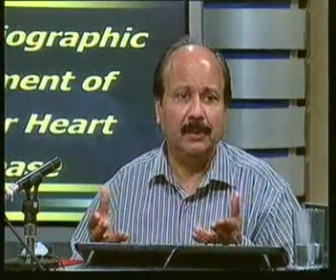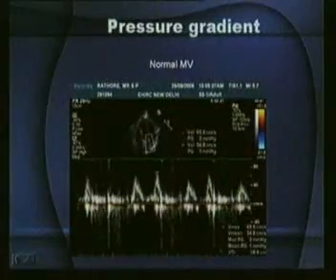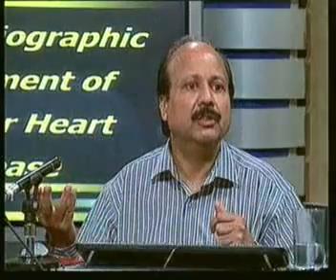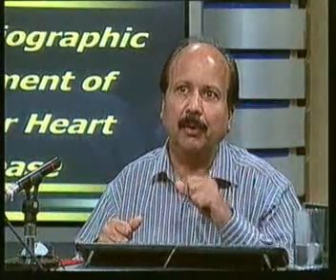Now you can very well imagine if the patient gets atrial fibrillation, then you're going to lose that A wave, right? Because now the atria are not contracting in a synchronized fashion. What will happen to the patient? A patient with atrial fibrillation and mitral stenosis might come to you immediately with palpitation, but more importantly with signs of congestion, because now his LA is not emptying. He gets back pressure, he gets pulmonary venous congestion. It's very common to find young patients who till yesterday were doing relatively well. Within 1 hour, the A wave is knocked off and they're down in left atrial decompensation, right? So that's the importance of the A wave here.